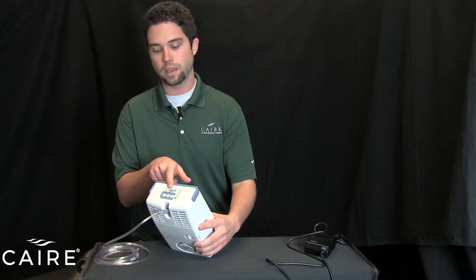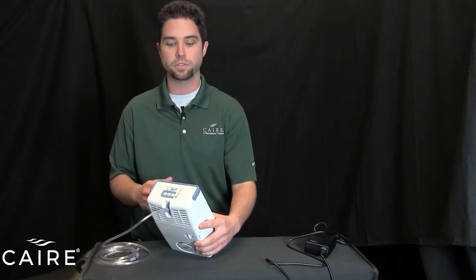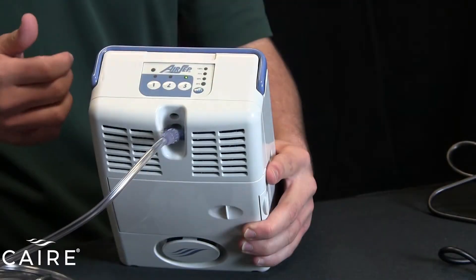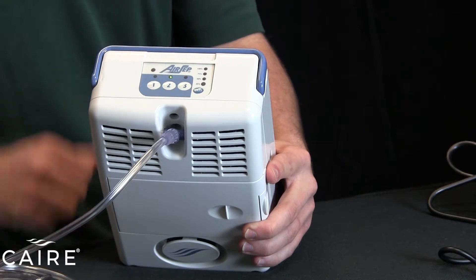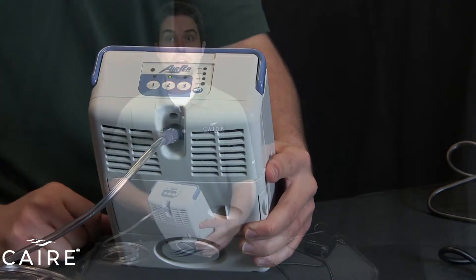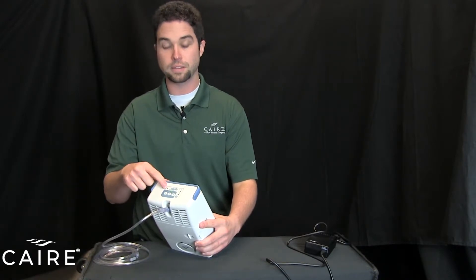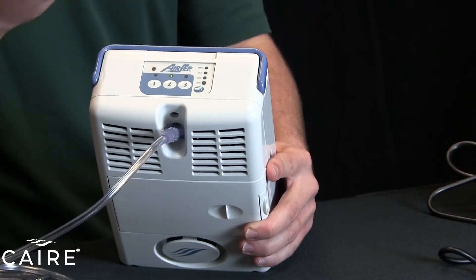Very easy to use and very simple. Note that each setting has a light above it to tell you when you're on it. If you need to switch flow settings, all you do is press the number of the new setting you're changing to. So if I want to change to a setting of two, I simply push button two and now we're on the different setting and the light above it has illuminated. The only other light on the device you'll need to note is one for alarm conditions — that's this one up in the top corner. If this illuminates yellow or red, there is a fault with your device. You'll need to reference your user manual for that.